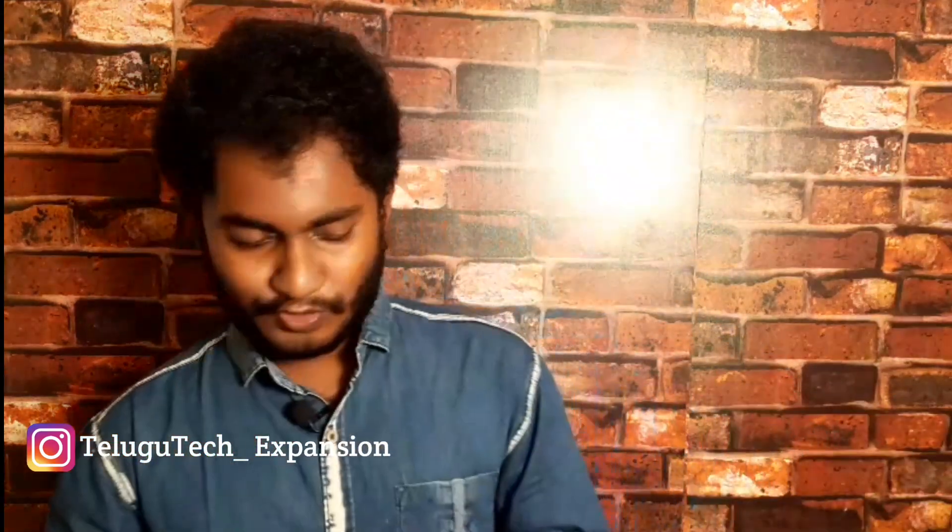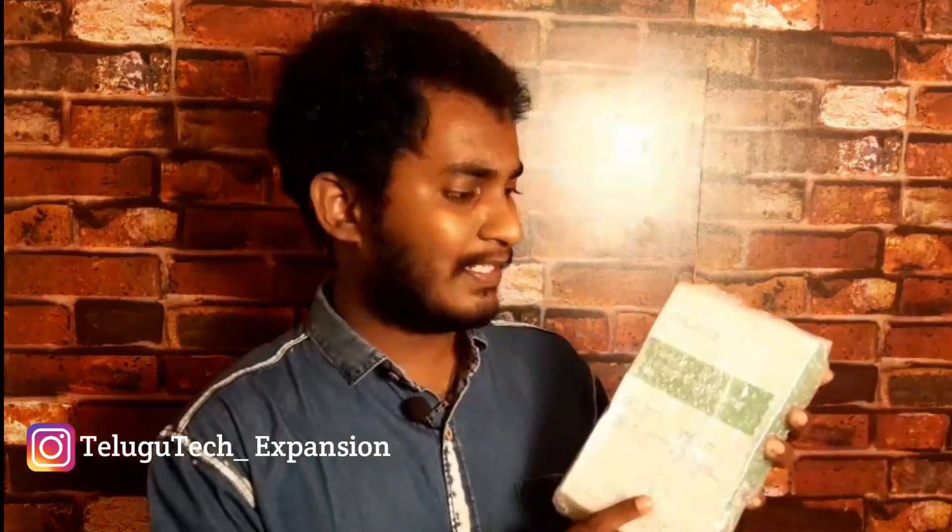We have Flipkart packing. We will open the product. After packing, there is a lot of bubble wrap cover. This is the medical infrared thermometer.